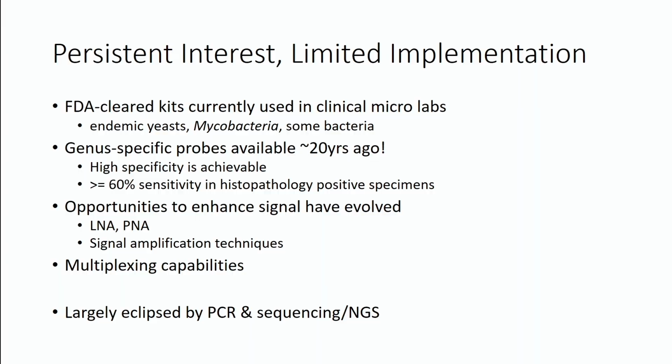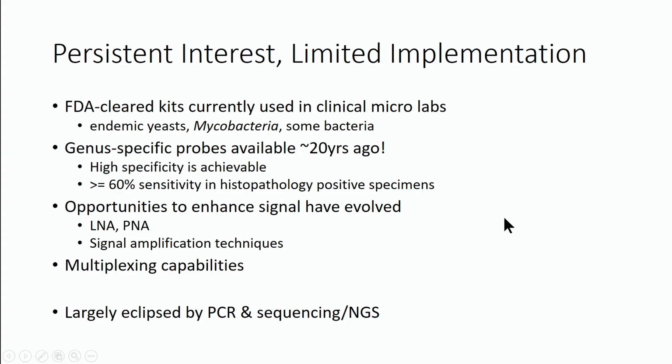Work in Steve Salipante's lab, I think, is getting to that. And the sensitivity is also relatively high. Probably not as high as PCR, so not a replacement, but I think filling in a gap where sometimes all of your tools don't work. There are other ways to biochemically enhance the binding, as well as to enhance the signal amplification. So at Pathology Presents, there will be a fabulous speaker, Brian Beliveau, next week at 4:30, who's talking about SABER-FISH, which is one of these possibilities for chaining together different molecules to encode more information and to amplify the fluorescent signal. So I will be there.